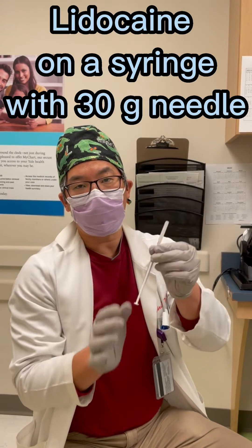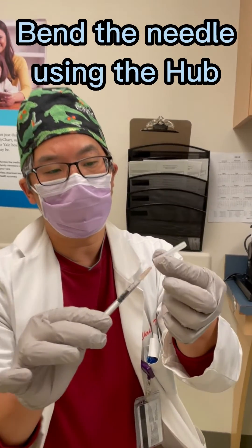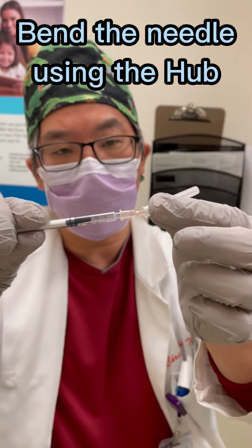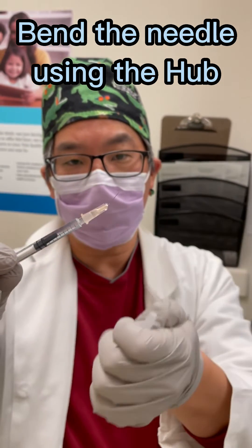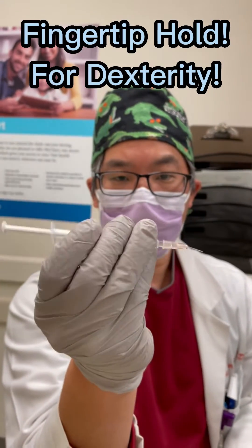I've got lidocaine here on a 30-gauge needle and I'm going to bend the needle to give it a nice bevel. You just do that bevel up with the hub here and then you bend.